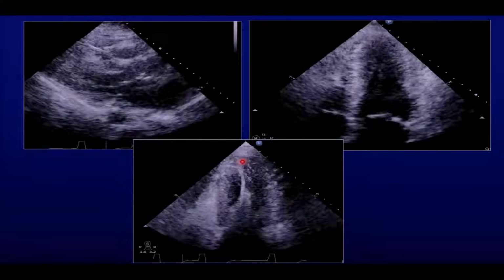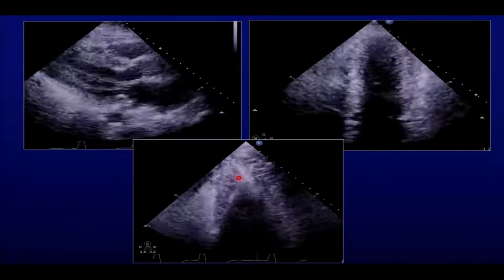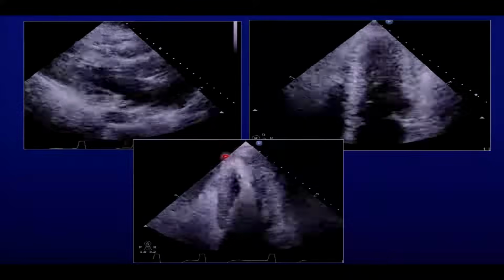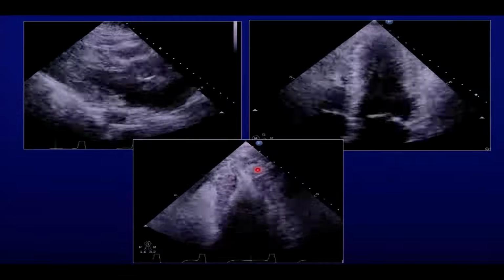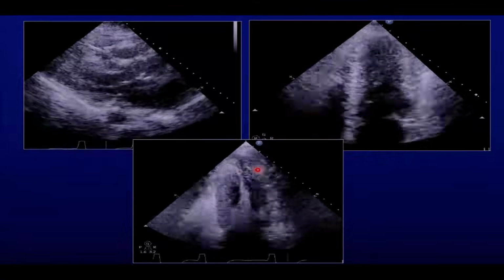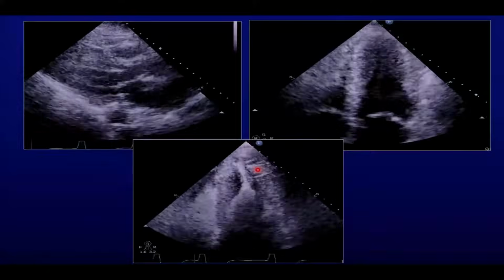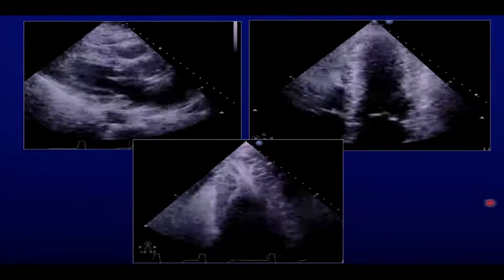And you could see some arterioles come in there, you could see the contrast coming in, and at times you may see an apical sequestration. It's a mid-cavity almost obliteration with apical sequestration that becomes problematic. It may grow into an aneurysm, and actually it has arrhythmogenic properties, sudden cardiac death.